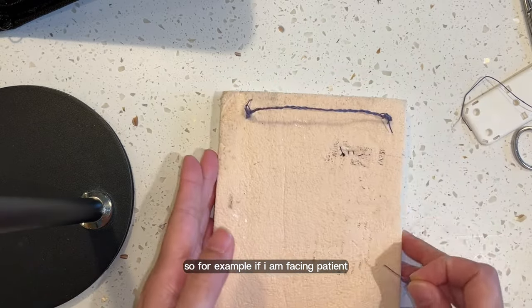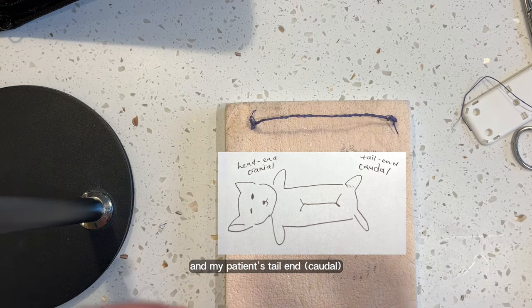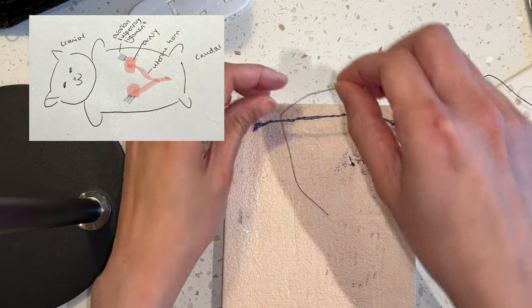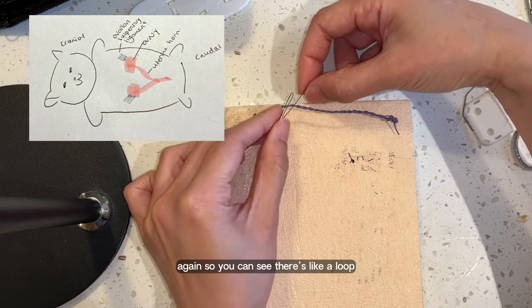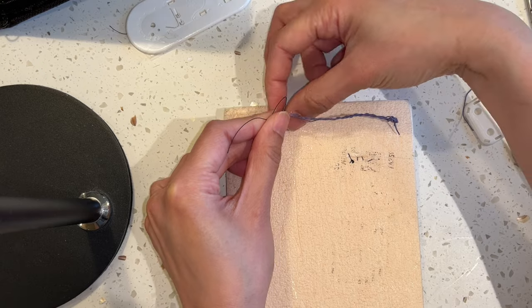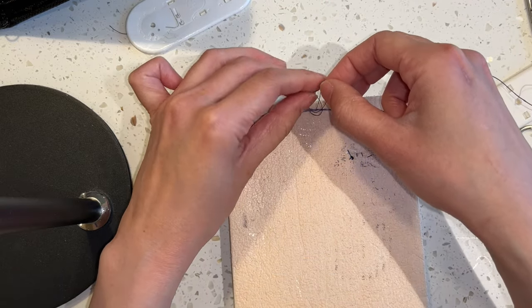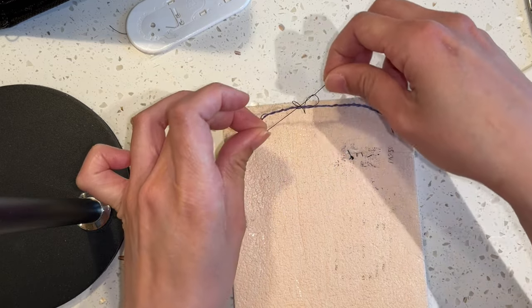So for example, if I am facing the patient, this will be my patient's head end and my patient's tail end — cranial, caudal — and my patient is up on a table. I want to go under here, and then under again. So you can see there's like a loop like this, and then you just go over each other. Like that.